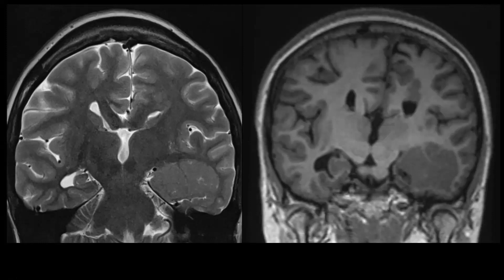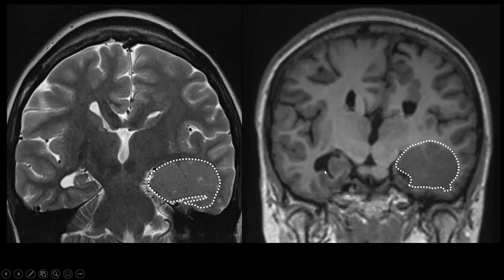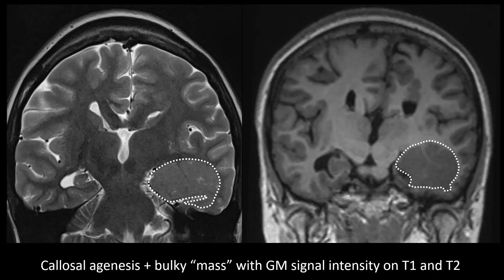Looking at this next case, we see the typical moose sign that we know from patients with complete callosal agenesis. So this is very likely a patient with callosal agenesis, and then we see a mass-like lesion in the left temporal lobe. We also have abnormalities that look like they have the same signal intensity as cerebral cortex — these look like gray matter heterotopias located above the left lateral ventricle.